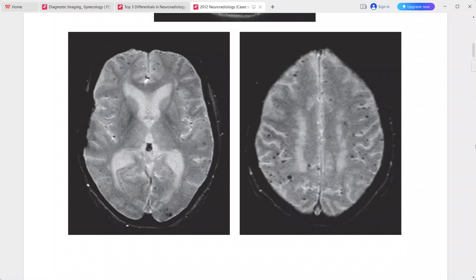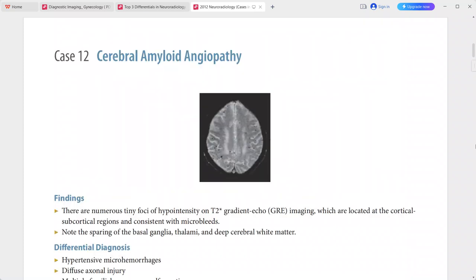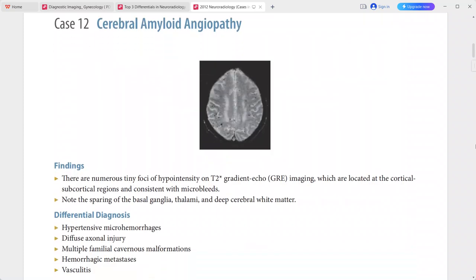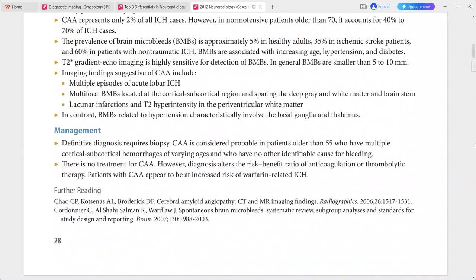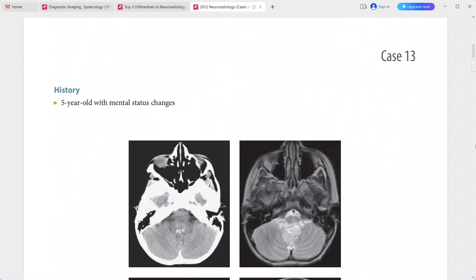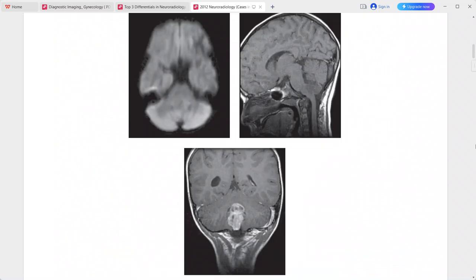Differentials include hypertensive microhemorrhages, diffuse axonal injury, multiple familial cavernous malformations, hemorrhagic metastasis, and vasculitis.